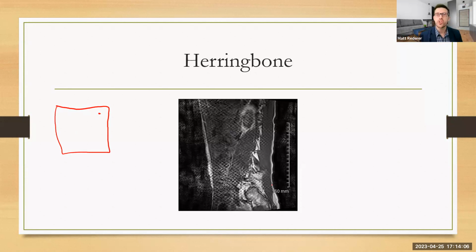We usually get this from a surge of power in the system or dust in the plug. So typically what I would do in this situation, so when I saw this artifact, what I did was I went in the room, I pulled out the plug from the table, and I treated it like one of those old Nintendos where I would blow in the plug, get all the dust out, plug it back in, works perfect. If it doesn't, then we would call for service.